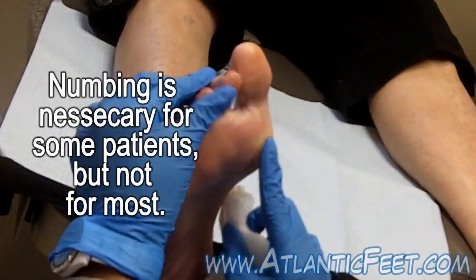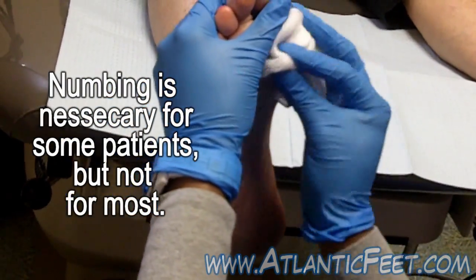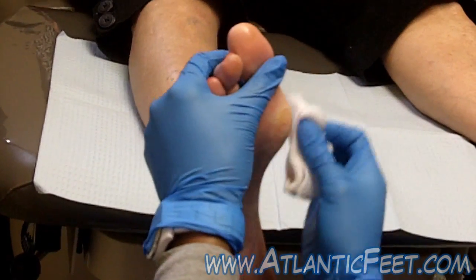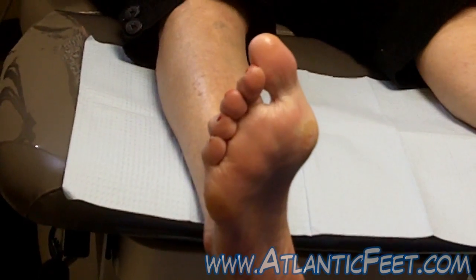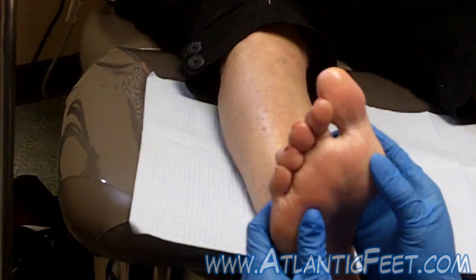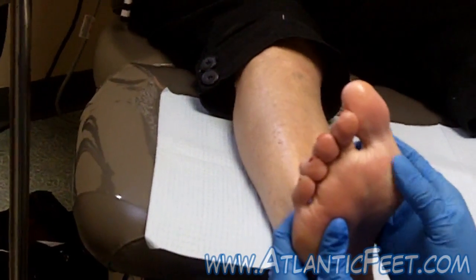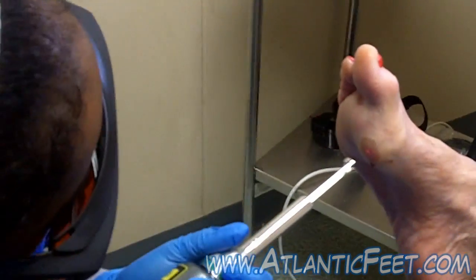Does it feel a little different? Yeah, it feels a little different. You feel pressure now but that numb feeling — you feel that? Yeah. There you go. All right, one tap.